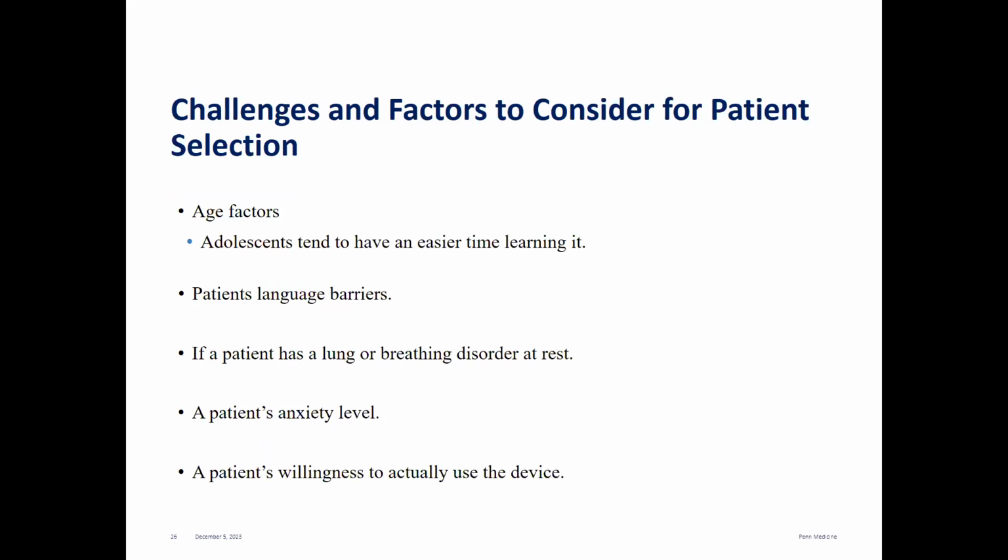So challenges and factors to consider when selecting patients. Age factors is a huge part. Adolescents tend to have an easier time learning it. They think it's fun. It's like a video game. Patients' language barriers. There might be a language barrier between you and the patient.